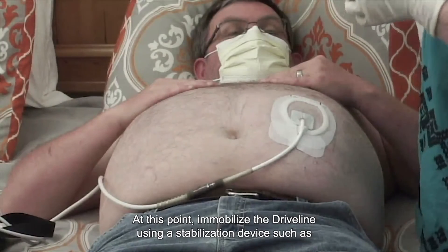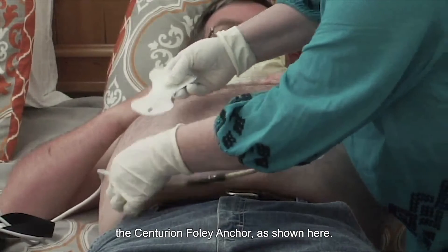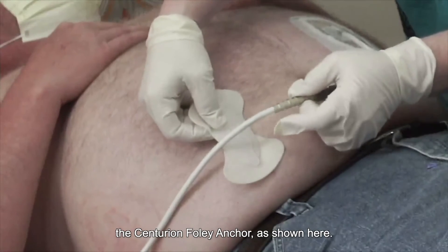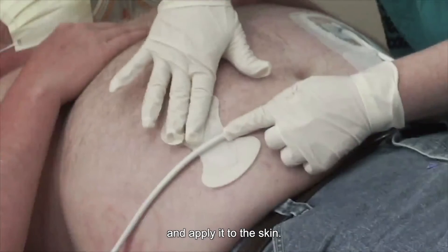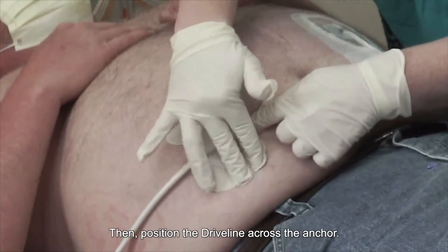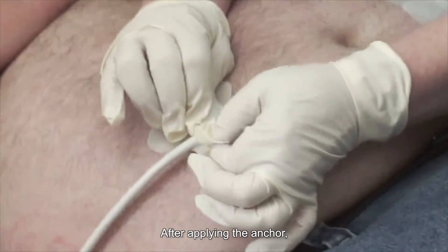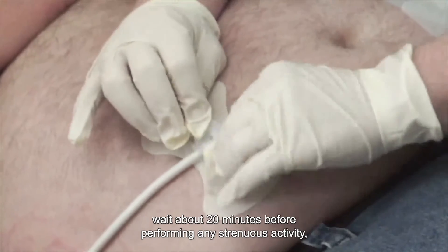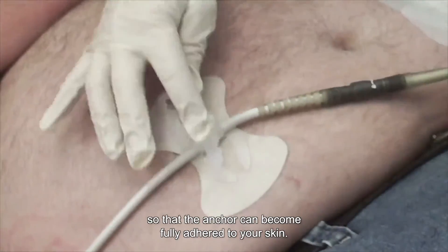At this point, immobilize the driveline using a stabilization device such as the Centurion Foley Anker, as shown here. Position it under the driveline at the desired location and apply it to the skin. Then position the driveline across the Anker. After applying the Anker, wait about 20 minutes before performing any strenuous activity so that the Anker can become fully adhered to your skin.